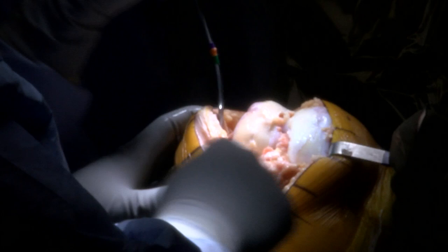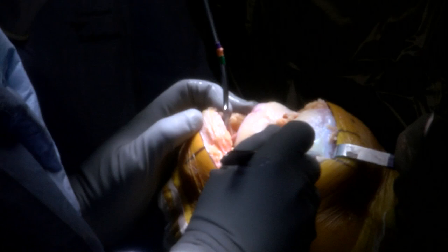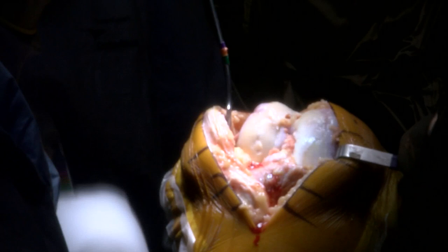Let me show you what's going on here. This is the end of her femur, the big bone in the thigh, and this is the top of the tibia, the big bone in the lower leg. Usually the cartilage surface over the bone is completely pristine, nice and white and shiny. But if you look on the inside portion of her knee, she's completely worn through the cartilage in that area — so that's just bone, no cartilage covering it. Instead of two smooth surfaces, it's like two pieces of chalk rubbing together, causing a lot of inflammation and pain.